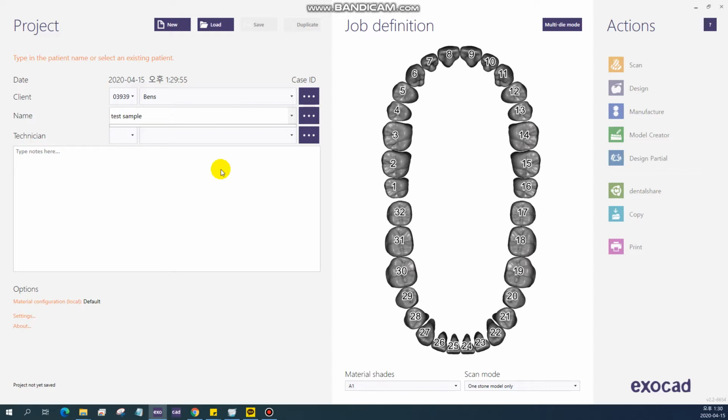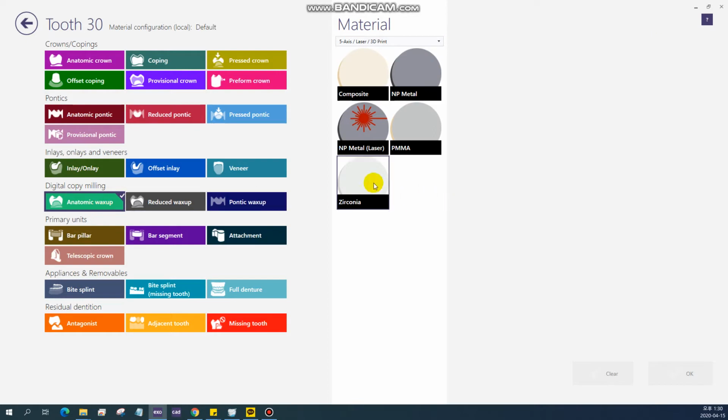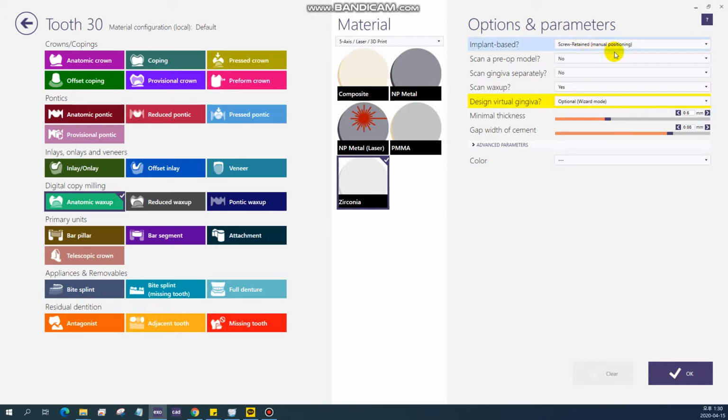Okay, we can put on the test sample, and you have to pick anatomic wax up, anatomic screw retain. We already have the abutment, so we can pick screw retain manual positioning, and you have to change the wax up option to digitally. And I like to always pick optional, like in this case. Even if the doctor wants it or not, sometimes I need to put in an additional design with the gingiva. So you can pick it like this, and okay.